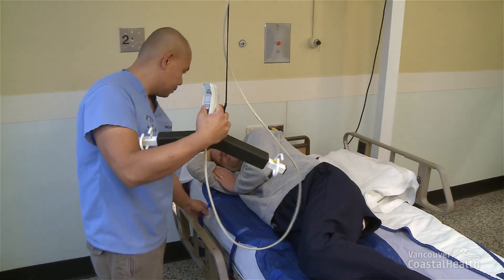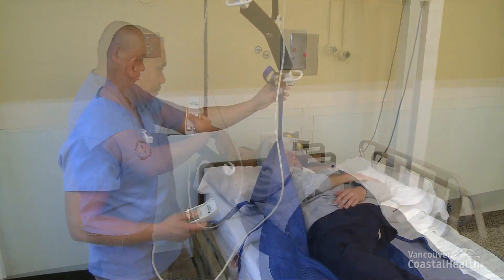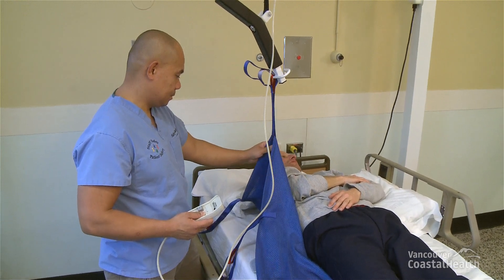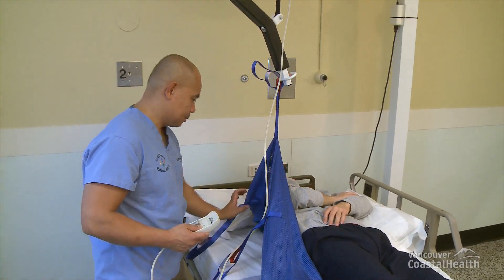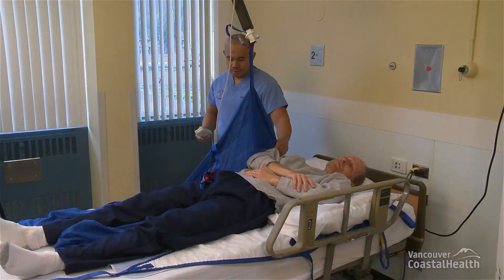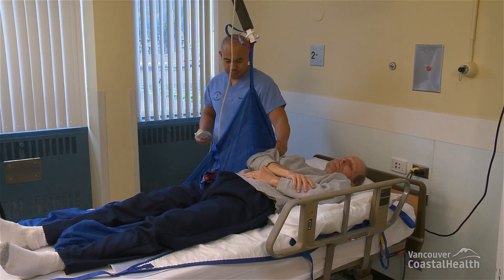Connect the other side of the positioning sling to the carry bar at shoulder level. Raise the lift's carry bar. The resident will start to turn towards the side of the disconnected sling. Stop when you notice that the positioning sling is starting to slide under the resident.